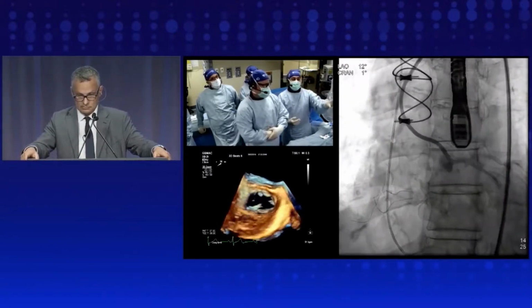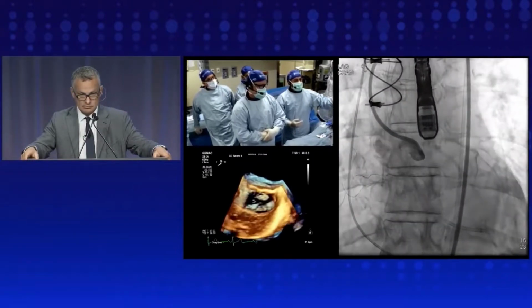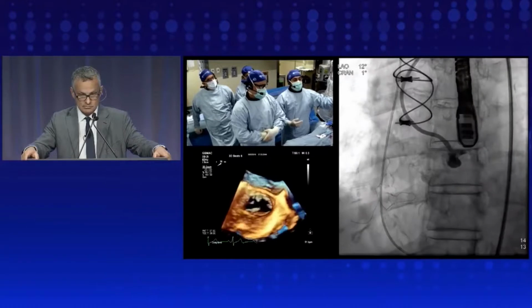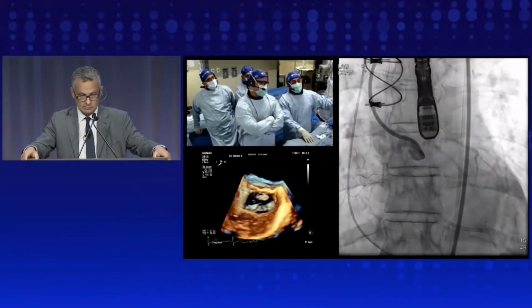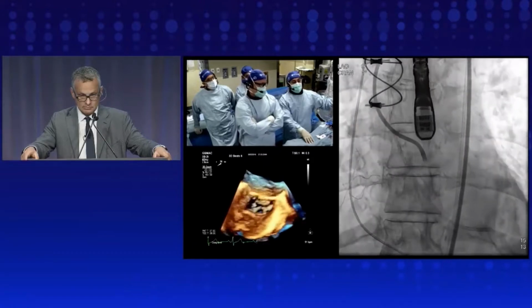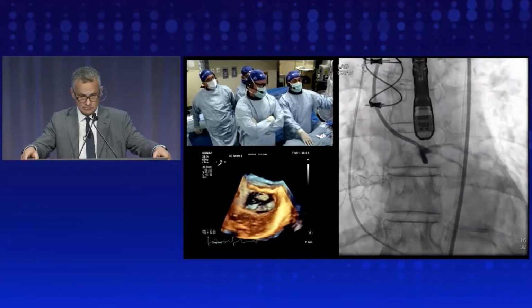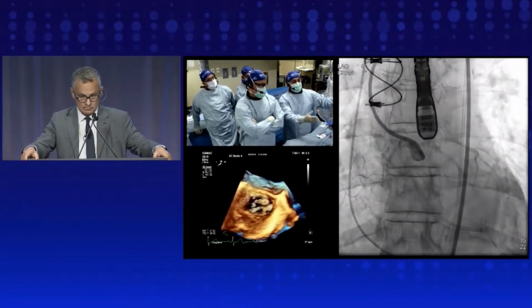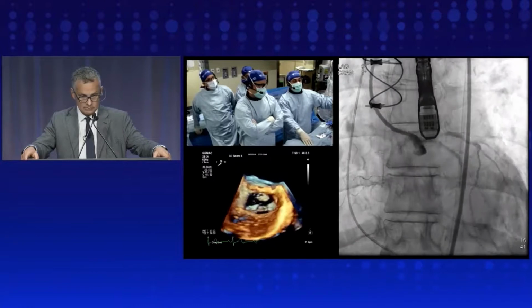This is the side view of the left cusp. And basically, here we used an AL3 injection, and I switched to an AL4 8 French. I found the AL4 8 French was very challenging to have, but it's the right guide for this case because the aorta is dilated.